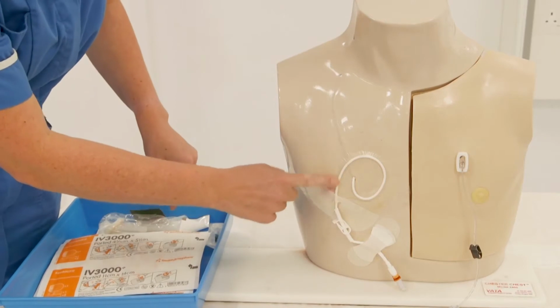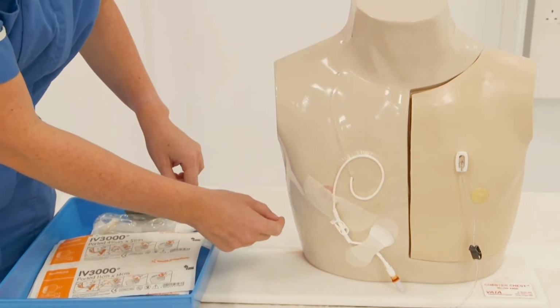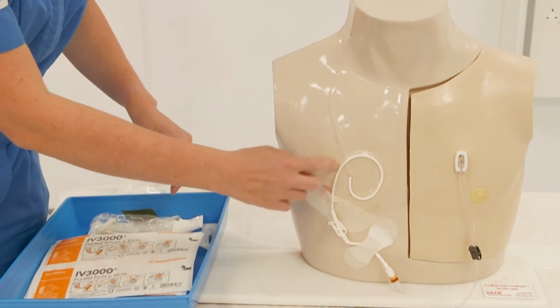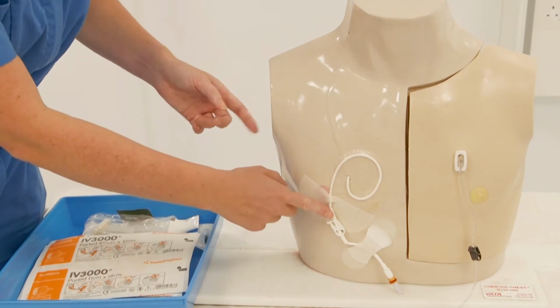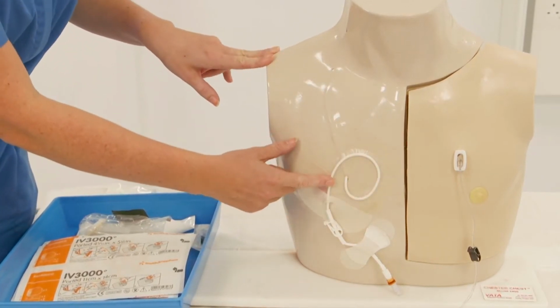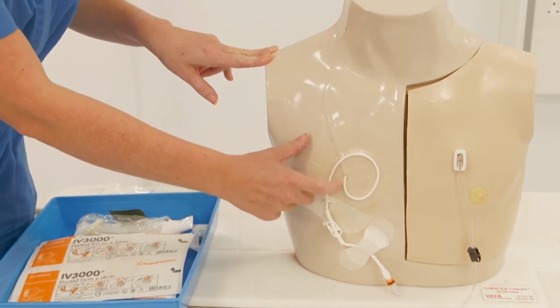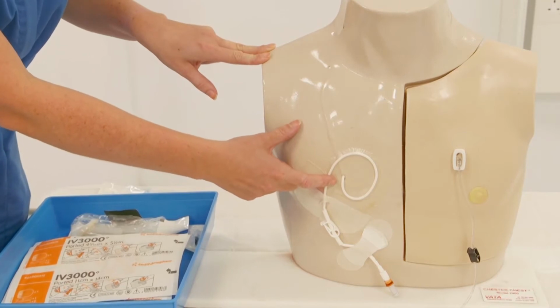So if we look at this line, there's a nice coil underneath that dressing, and that's just to make sure that if that line gets pulled, it's going to pull the coil of the line instead of the line coming straight out. So if your line is long enough, wherever possible, make sure that that line is coiled. When you do so, just be careful not to kink the line itself, otherwise it will become blocked and you'll end up having to change the dressing again.